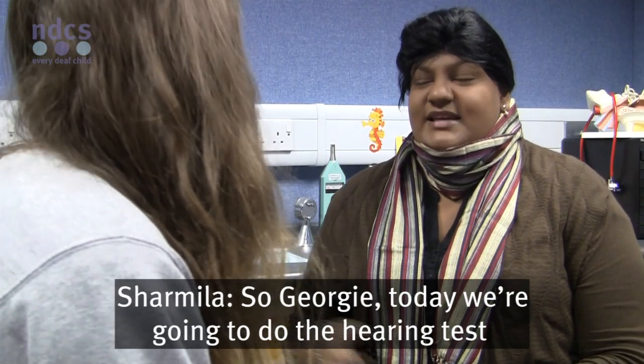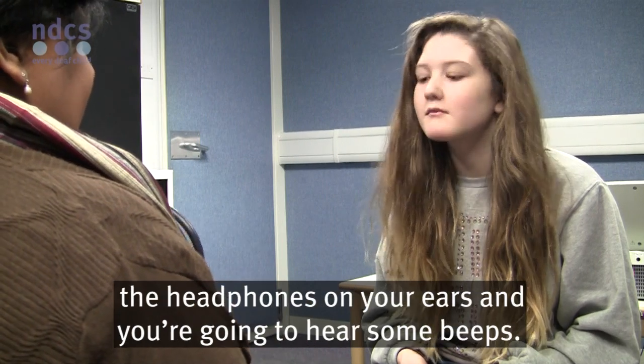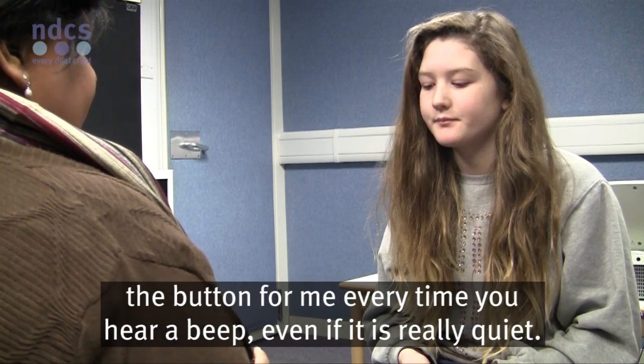So Georgie, today we're going to do the hearing test, and you've done this before. What I'm going to do is I'm going to put the headphones on your ears and you're going to hear some beeps. And I'm going to give you a button. I want you to press down on the button every time you hear a beep, even if it's really quiet.